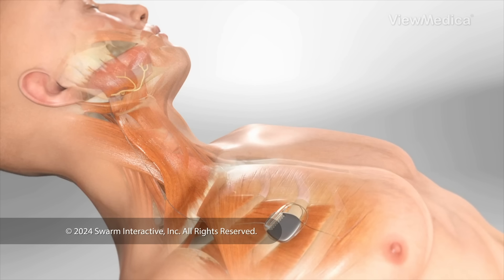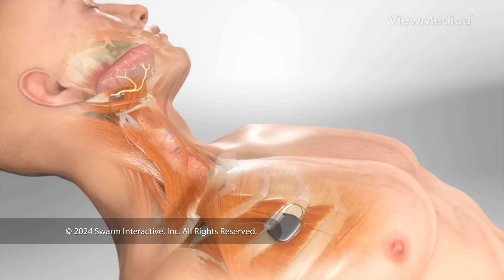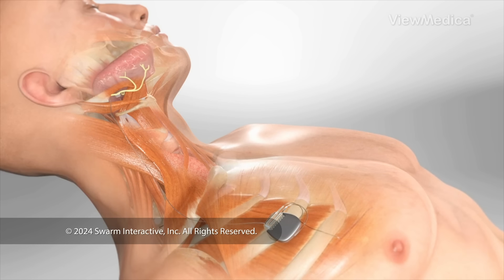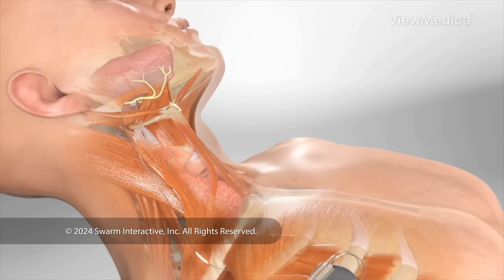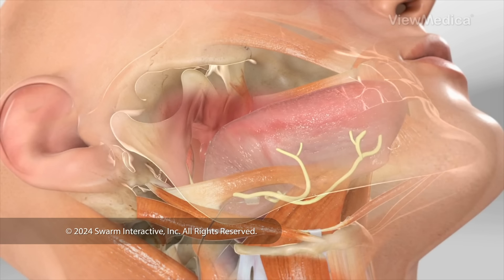This surgery implants a stimulator device below your collarbone. When you sleep, it sends gentle pulses of electricity through a wire to a nerve in your tongue. These shocks move your tongue forward to keep your airway clear.